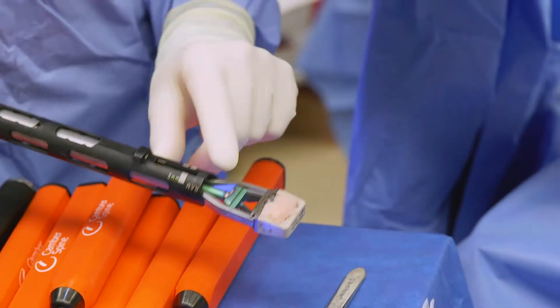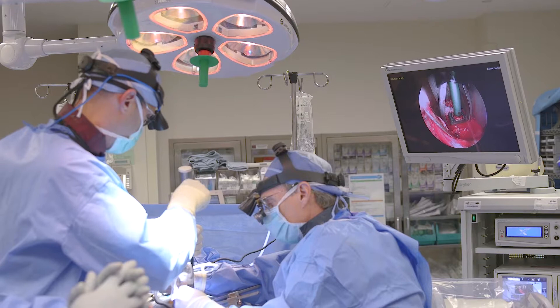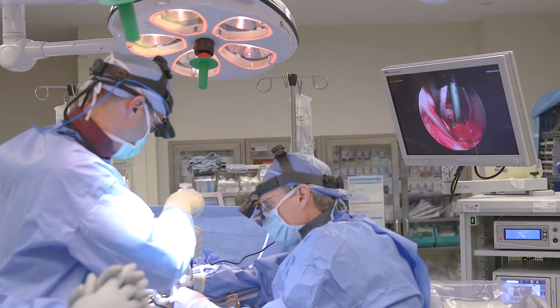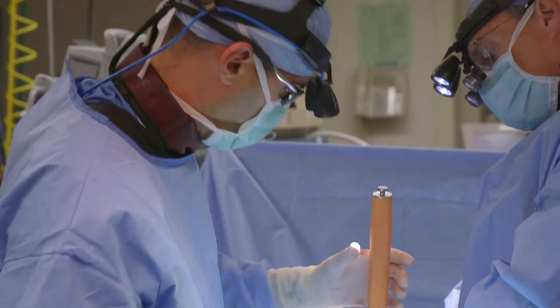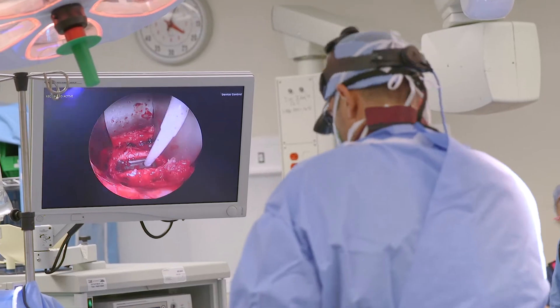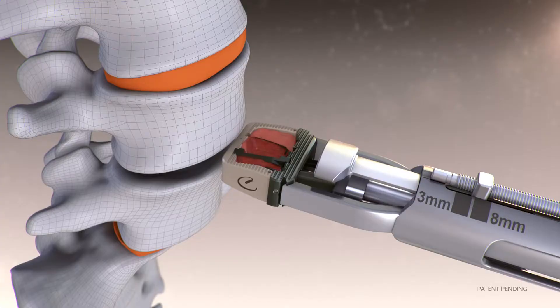You'll see one of the features that we really like, and I think a lot of us would agree that impaction grafting — at least for the orthopedic surgeons out there — we recognize the benefit. Bone doesn't like to jump, so bone needs direct contact with a surface to fuse, and the spine is no different. We do have some luxuries in the spine, but we still need good contact of our bone graft and our bone.